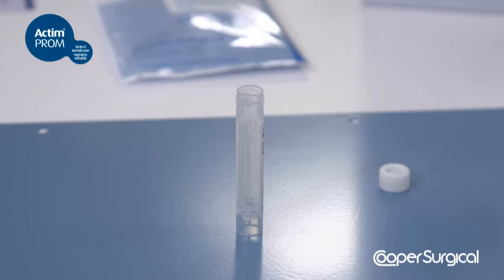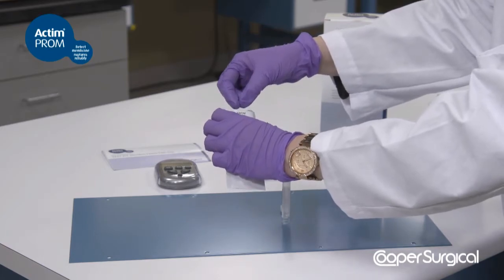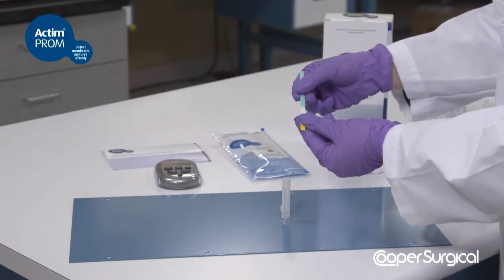The specimen should be tested as soon as possible after extraction and no more than 4 hours after specimen collection and extraction. Tear open the foil pouch and remove the dipstick for testing. The dipstick must be used shortly after it is removed from the foil pouch.